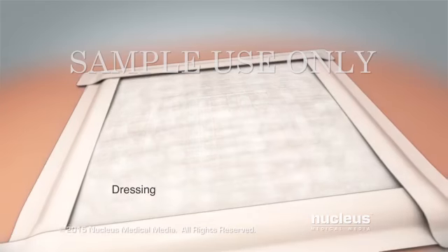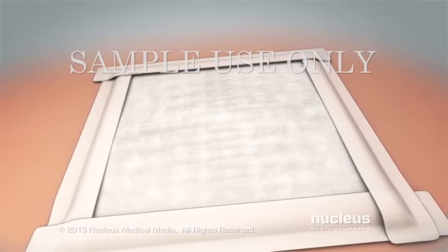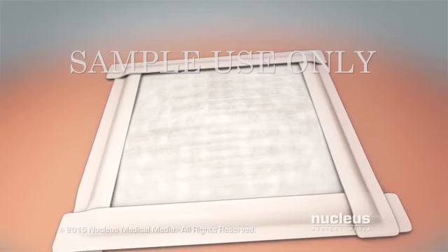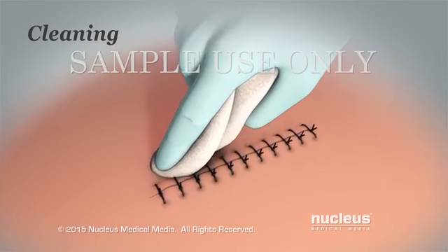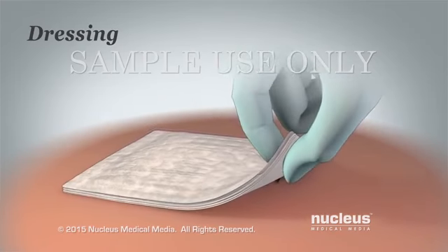A bandage called a dressing covers your incision. To prevent skin infections, keep your dressing clean and dry. Taking good care of your incision will help it heal more quickly. Caring for your incision involves cleaning your incision and changing your dressing.